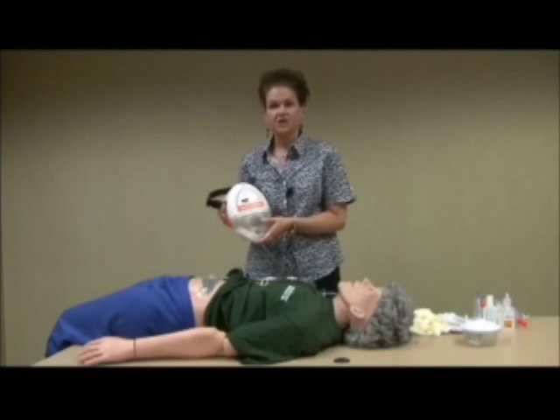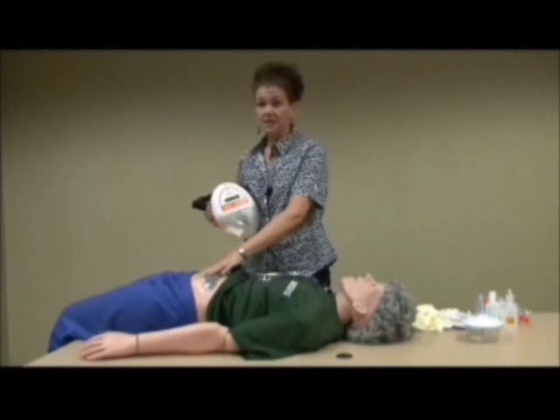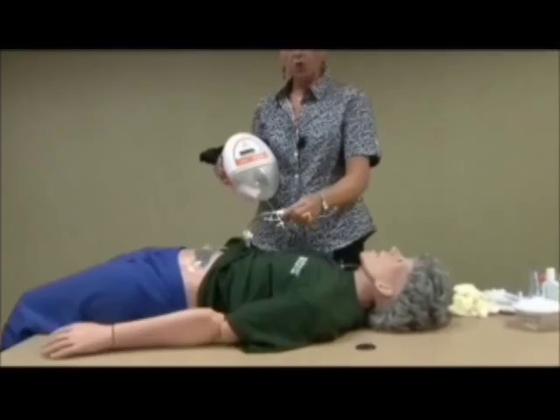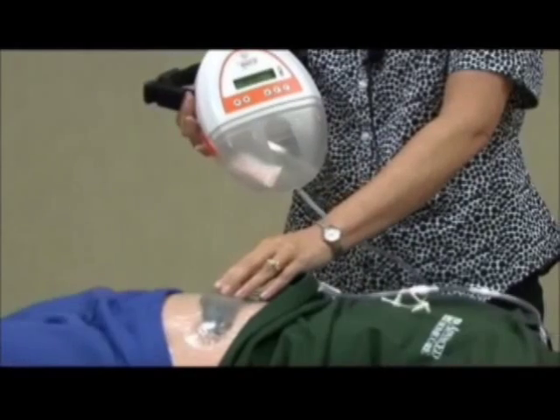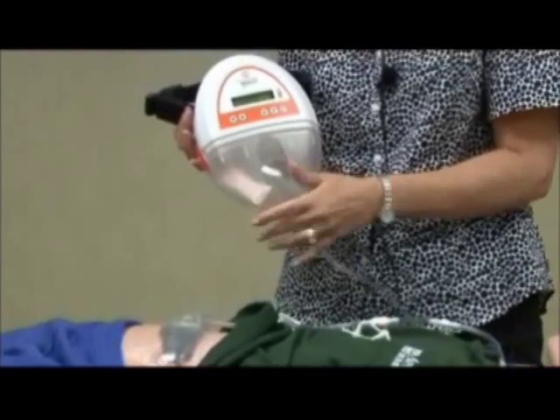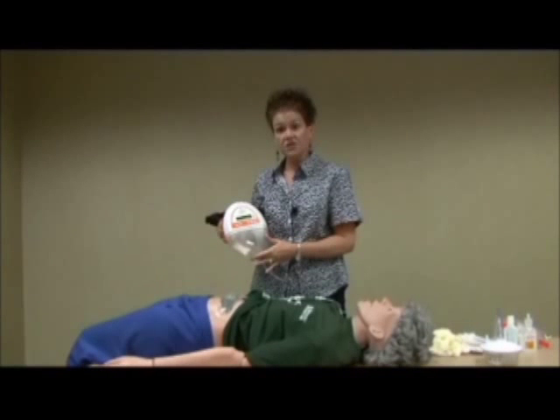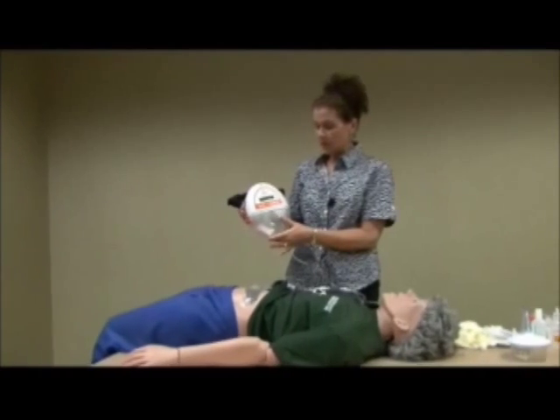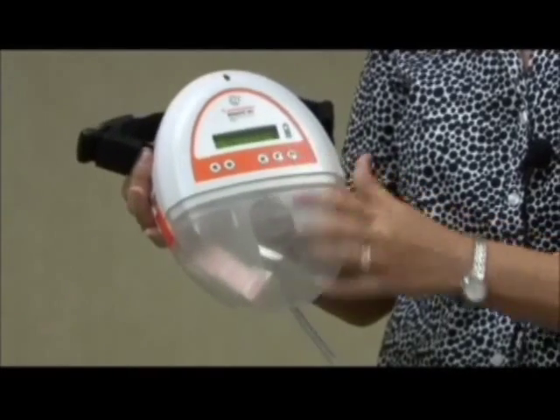If your negative pressure machine should alarm low vacuum, you'll need to try to reseal your dressing. However, first you may want to check all of your connections to make sure they are secure, here at the dressing and canister connection, and here at your dressing. If you are not able to determine that there are any leaks in your tubing, your home health nurse should have advised you on how to patch your dressing. You can silence the alarm on your machine by pressing the button with the alarm with an X through it. This will give you time to work on your dressing.